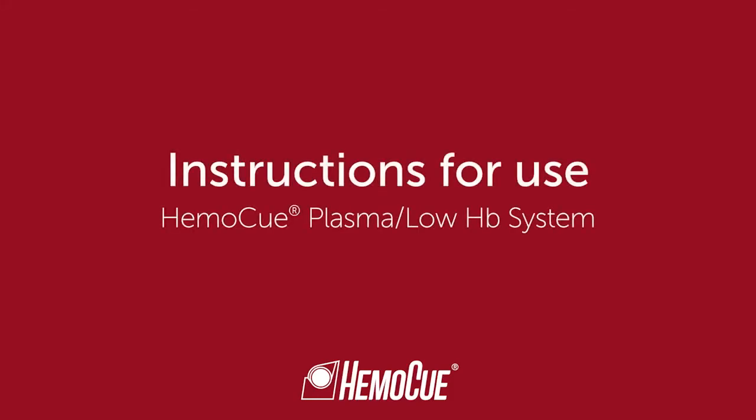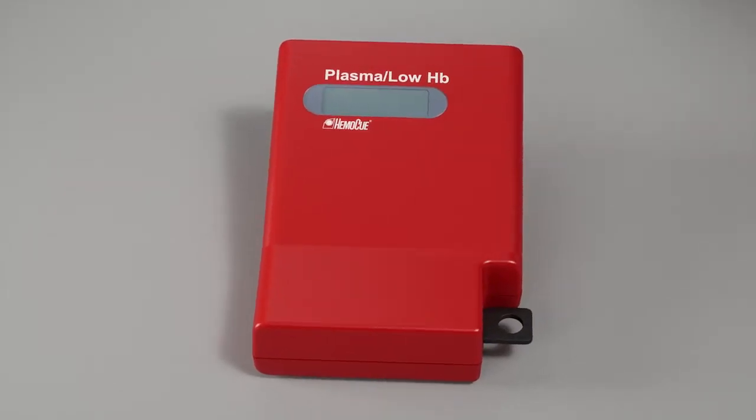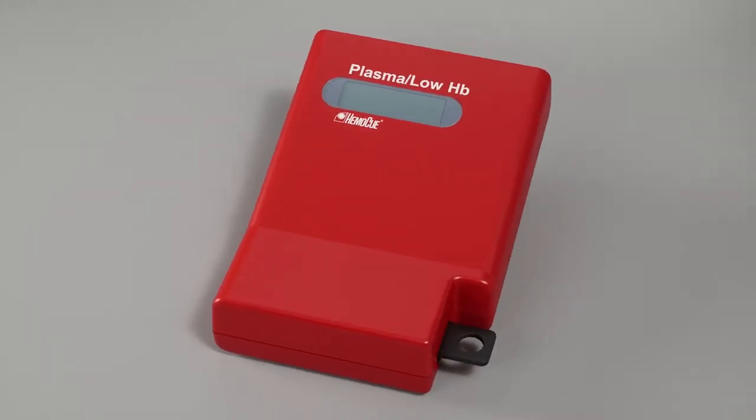Welcome to the HEMO-Q Plasma Low-HB System Instructions for Use on Startup, Measuring and Cleaning. Make sure the photometer is placed horizontally and on a stable surface.